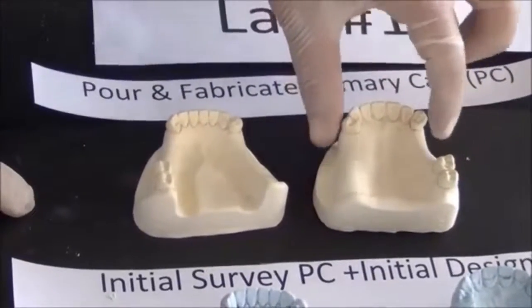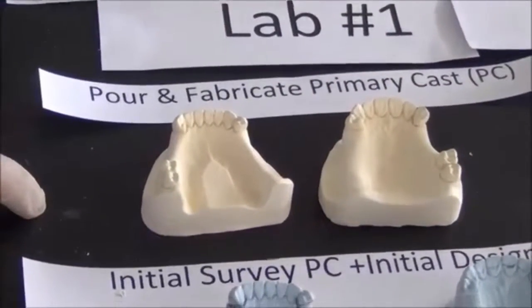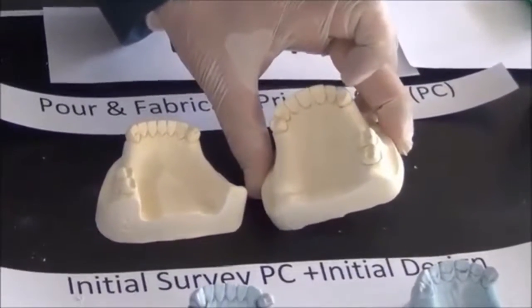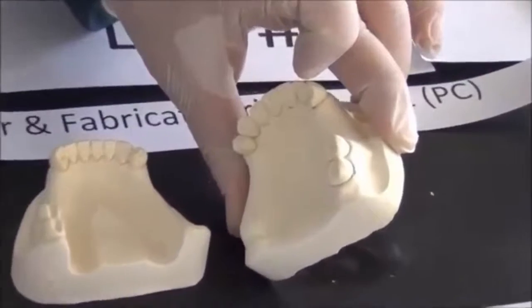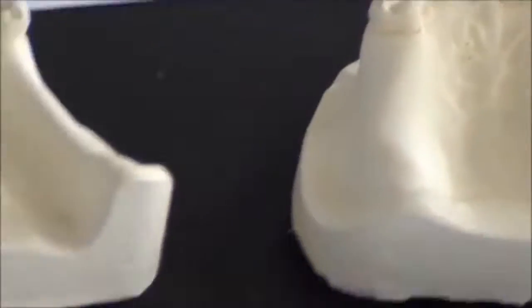Where am I going to place the teeth? Where am I going to place the components of the chrome cobalt that you have taken in your lectures? So I have to study this well. Studying it by vision will not be sufficient, because I could not see if there is an undercut and how much it is. I could not gauge it by vision. I need something more specific. For this purpose, I use what we call a dental surveyor.